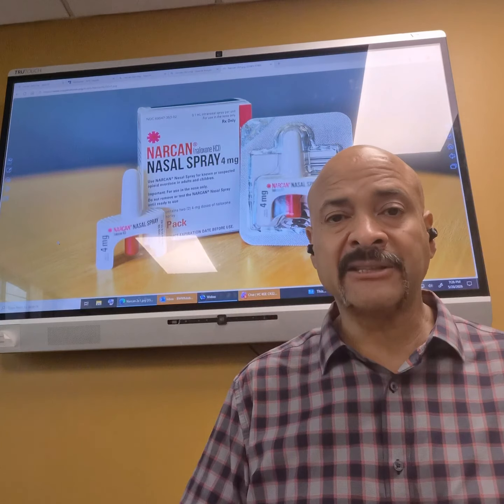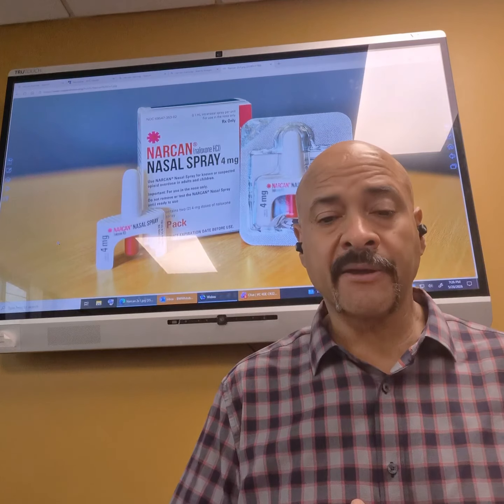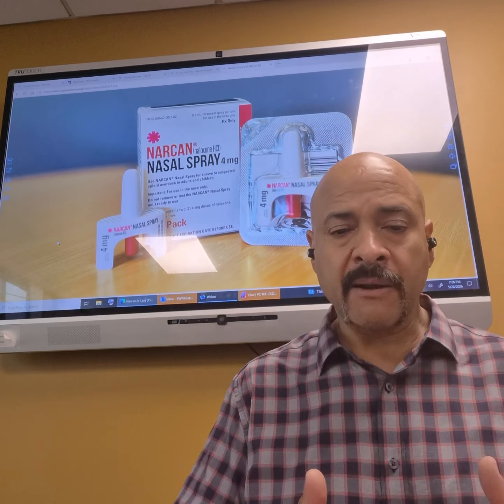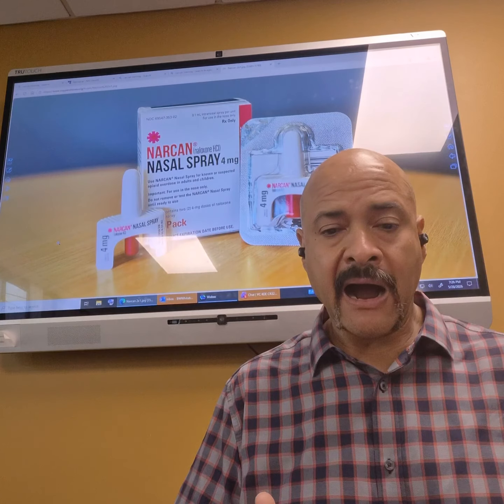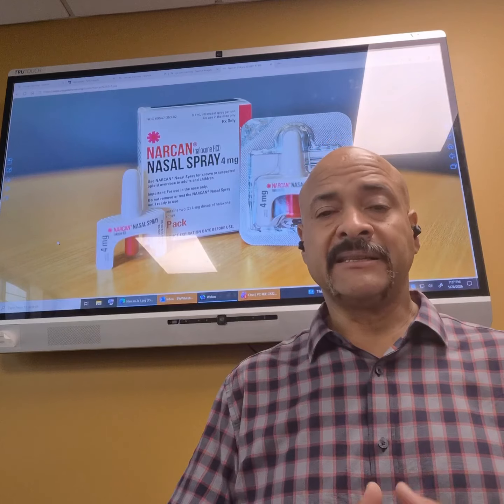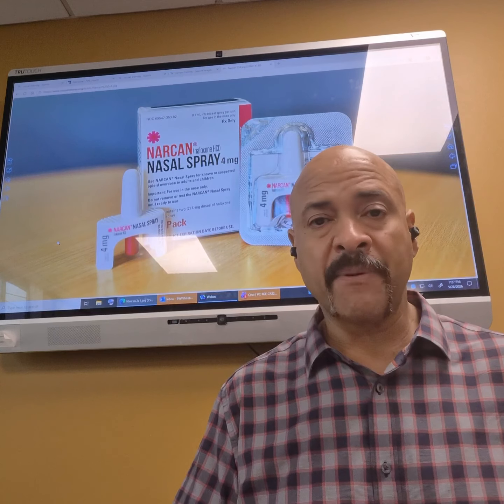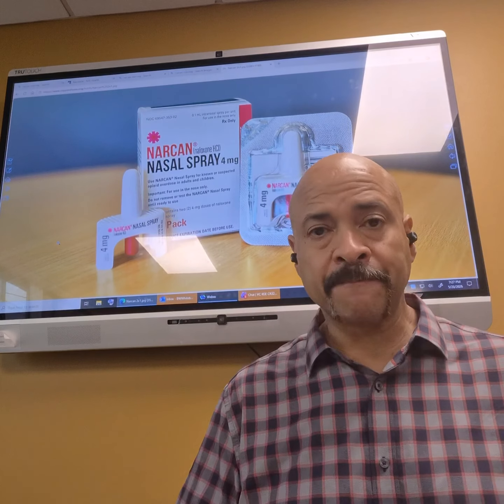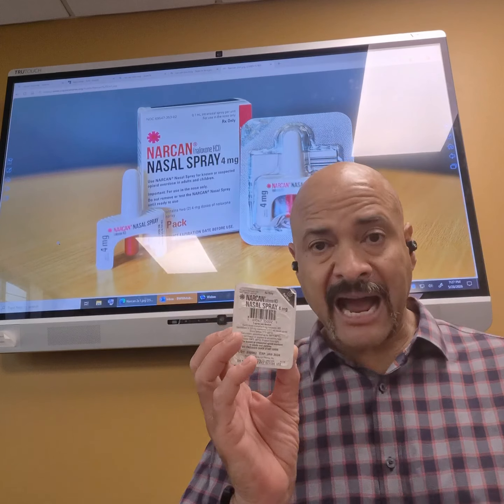If they don't respond to you shouting or calling their name, then you want to check to see if they're breathing. Just look to see if their chest is rising, to see if they are possibly having an opioid overdose. So at this point, we want to see about using the Narcan or naloxone.